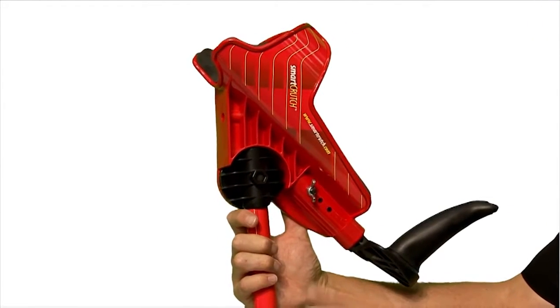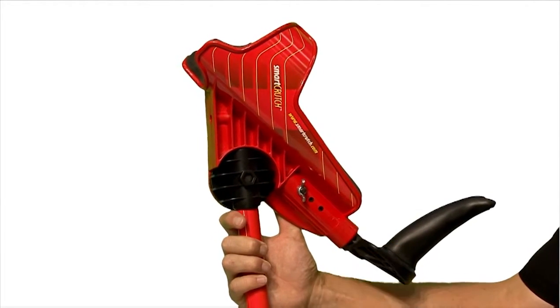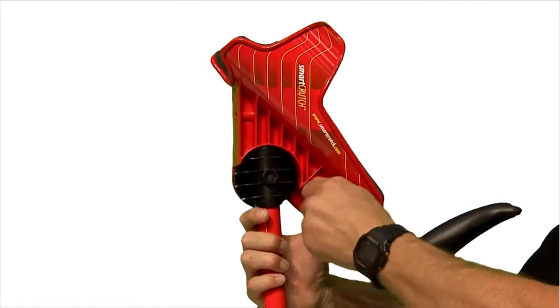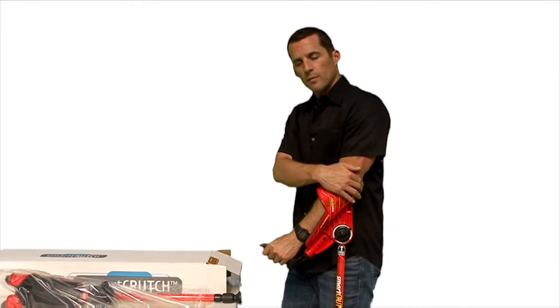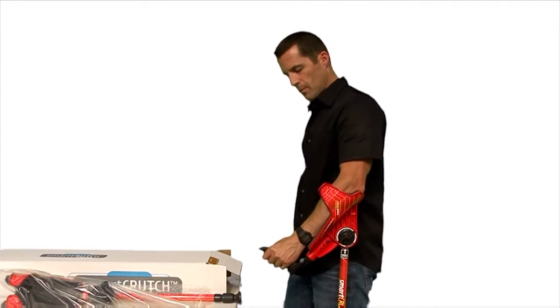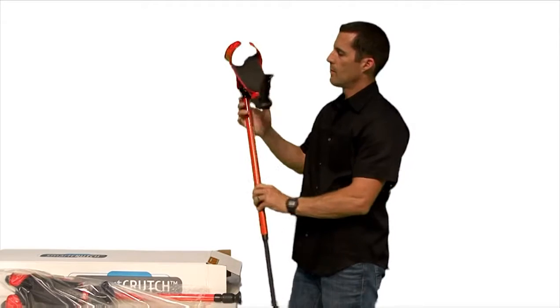Once you have the correct height adjustment, we now need to set the forearm length adjustment. As you can see, there are 3 forearm adjustment positions. With your arm through the cuff and your hand comfortably on the grip, check to see that your elbow is in line with the end of the forearm platform.